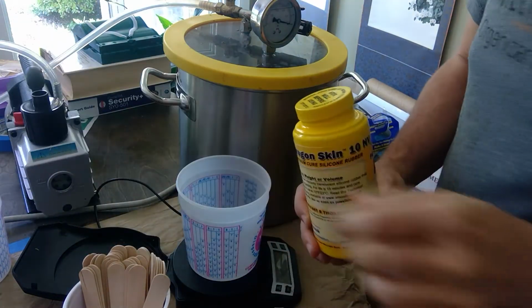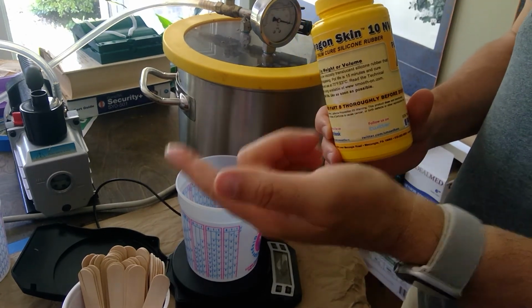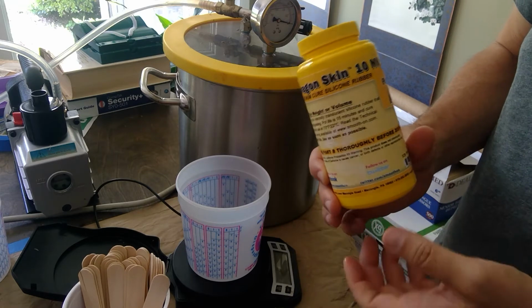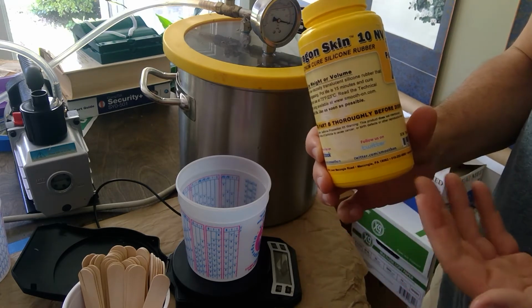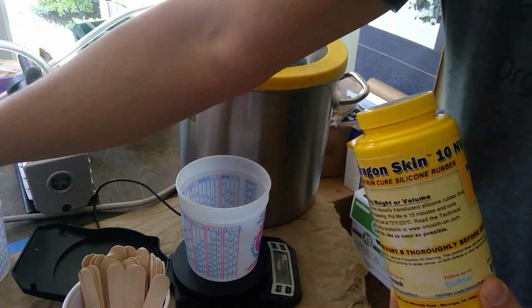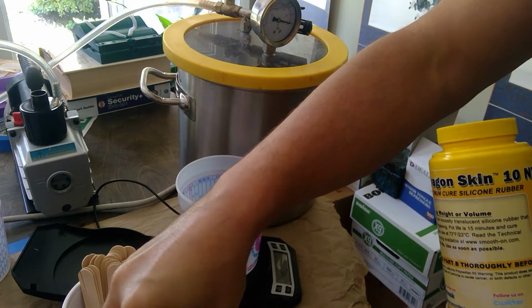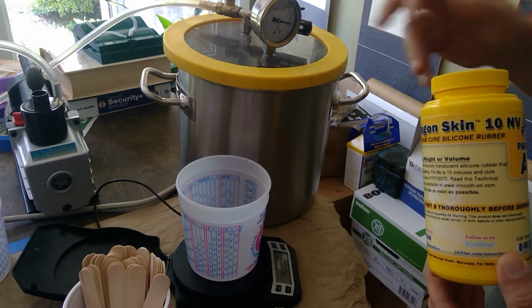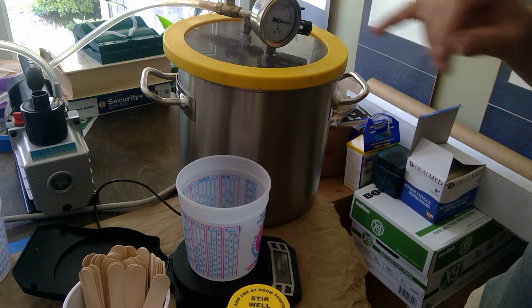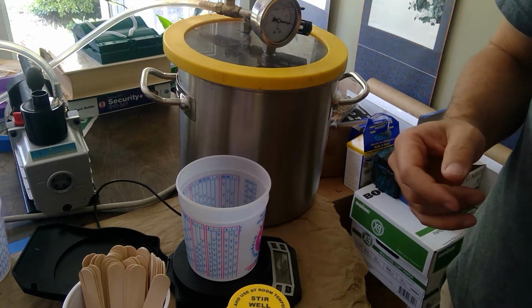So the steps involved in this, we basically use about 30 grams per mold of each material, and then just under 10% of Wonder Fluid in regards to the weight for one part of that. So we're going to do 5 molds, which means 150 grams of part A, followed with 12 grams of Wonder Fluid. Mix those two up, and then add another 150 grams of the Dragon Skin part B. After that, everything will go into the vacuum chamber for 3 minutes at minus 30 on the pressure, and then after that we have about 10 minutes of really functional pot life to get everything into the molds.